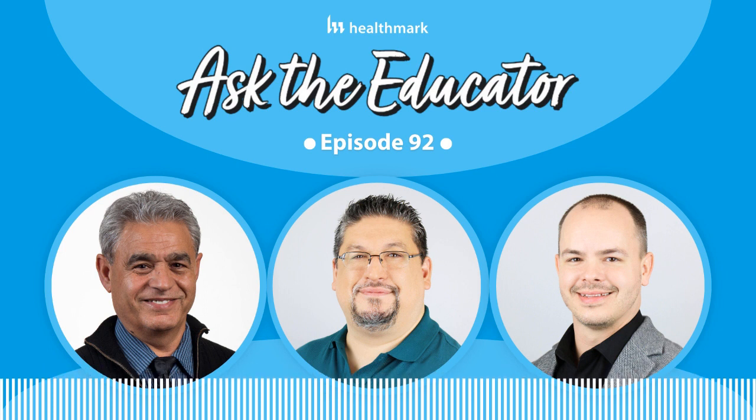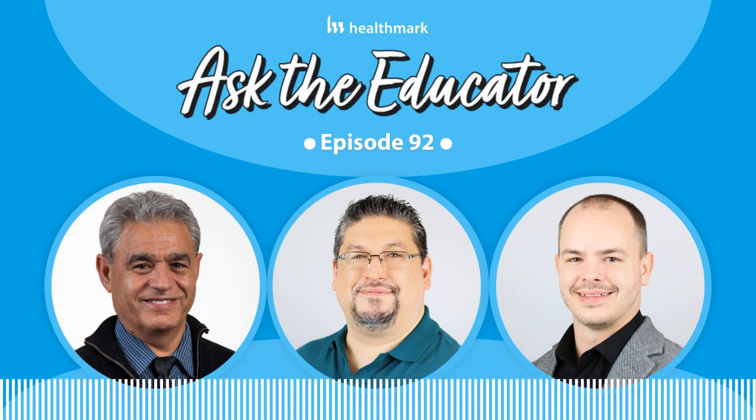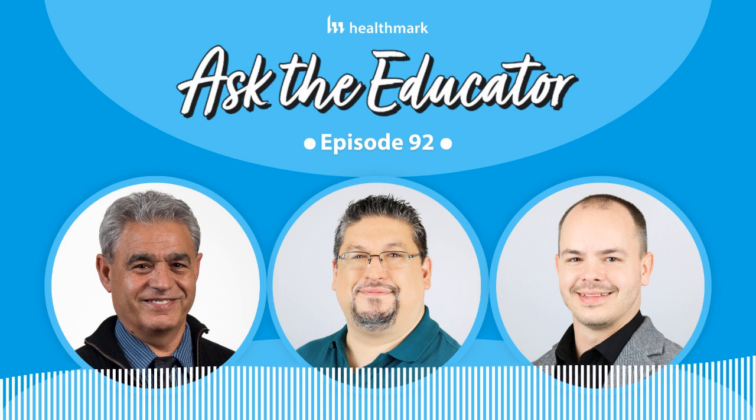And when we did the investigation, we found out that, first of all, these cords are not forever cords. Most of them have a specific shelf life, like 20 to 25 uses or reprocessings. But what happens is that even during those 25 uses, since you're pulling on the cord, and with the monopolar cord the end at the machine is really heavy, that adds more pressure to the conductors inside the wire. And then over time, they break.